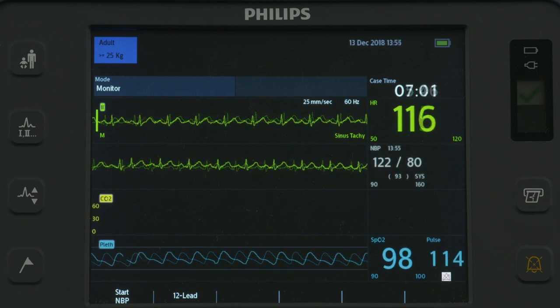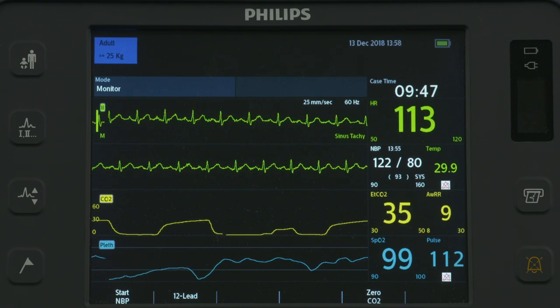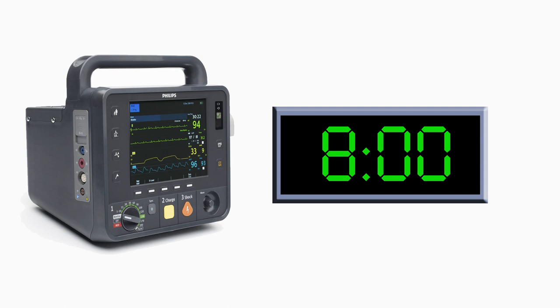Optional monitoring of non-invasive blood pressure, temperature, and/or end-tidal carbon dioxide is also available. The HeartStart Intrepid stores up to 8 hours of monitored trending data that can be displayed in time intervals on the screen.